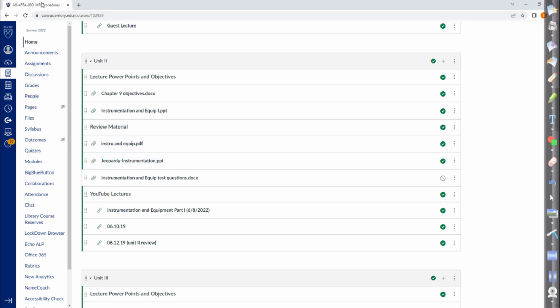Yes, x-axis is left and right. Y-axis is A to P. So the x-axis is going to create your sagittal slices because it's left to right. The y gradient is going to create your coronal slices. The z gradient creates your axial slices.